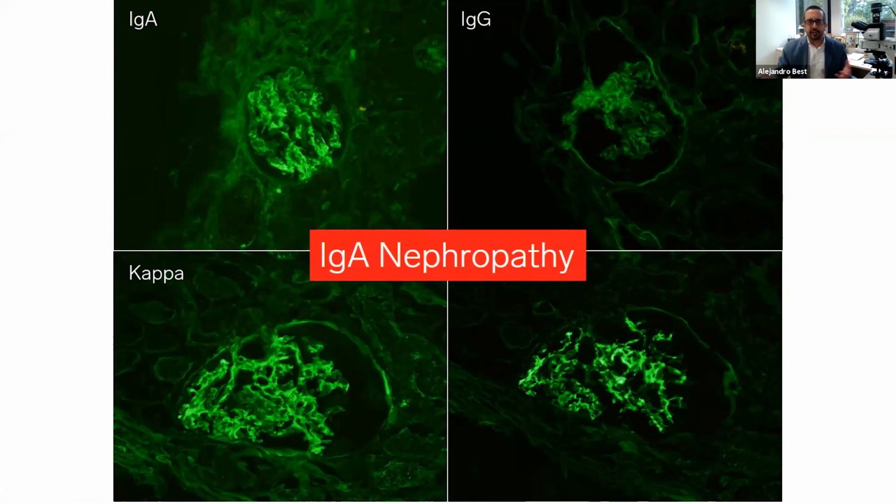I have to try to differentiate primary versus secondary IgA, chronicity, etc. But I know I'm dealing with an IgA, and there's very little that I can see in light or EM that will change my mind. I already know it's an IgA nephropathy.